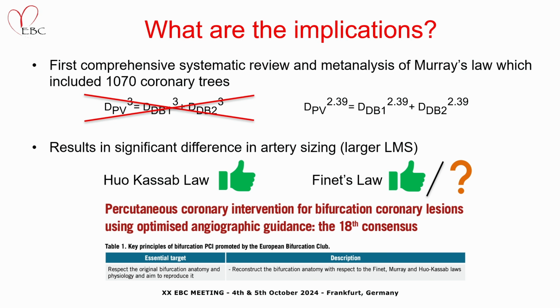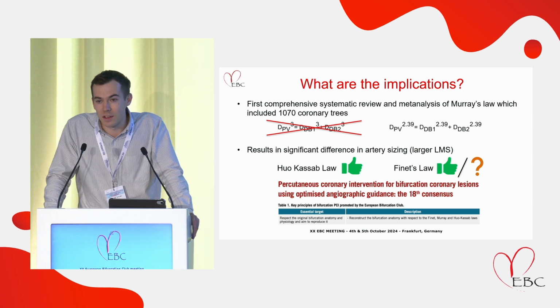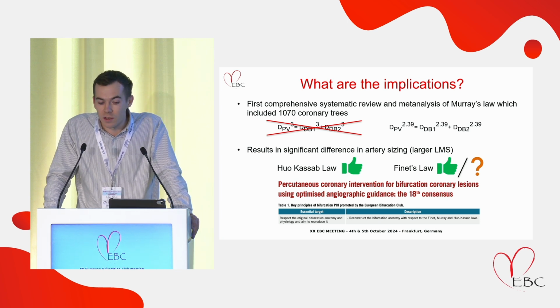And what does this mean for bifurcation PCI practice? Well, at the bottom here, I've got a screenshot from the EBC most recent consensus statement. And one of the big targets is to respect the original bifurcation anatomy and physiology and try to faithfully reconstruct this when doing bifurcation PCI.